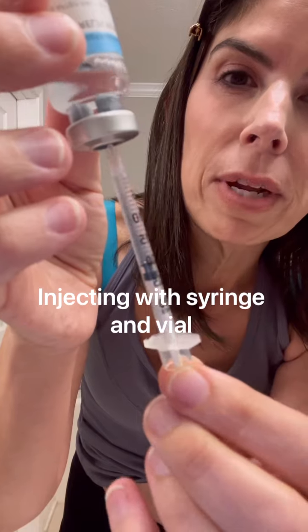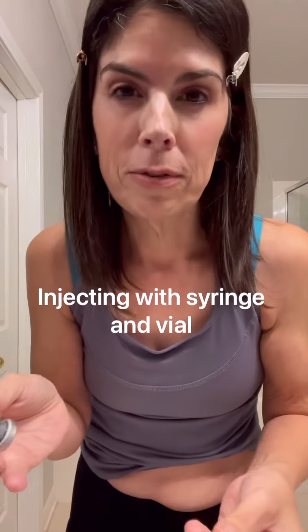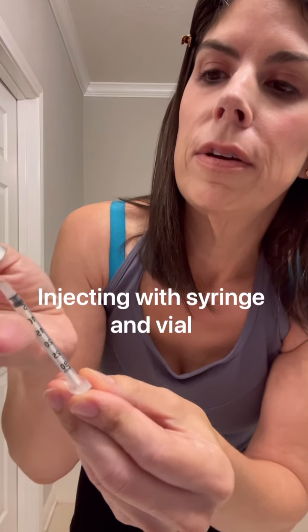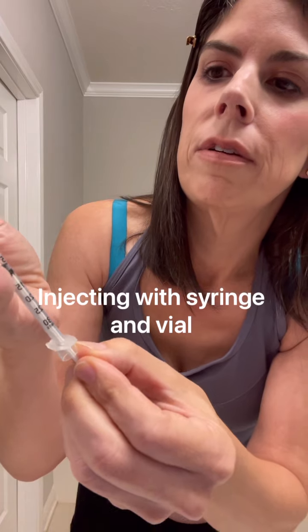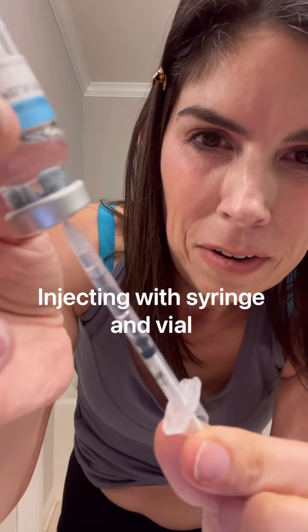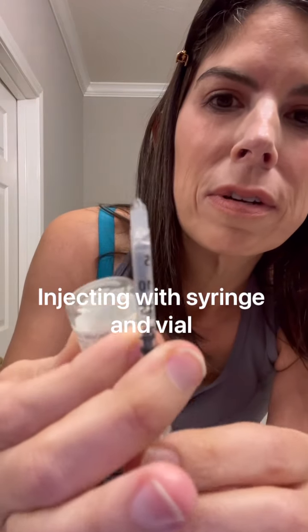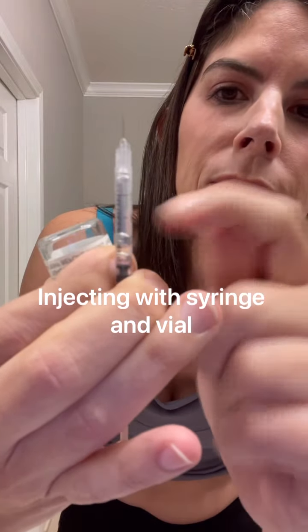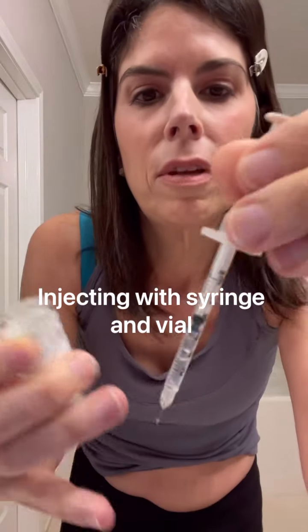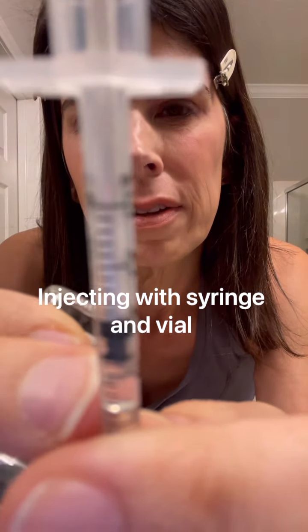If you're not yet seasoned at this, you may get some air bubbles in your syringe. You might think, 'I don't want to inject air into my body' — but injecting a small amount of air into subcutaneous fat won't hurt you. Still, you can tap the syringe and push the plunger slightly to expel the air bubbles out the top.